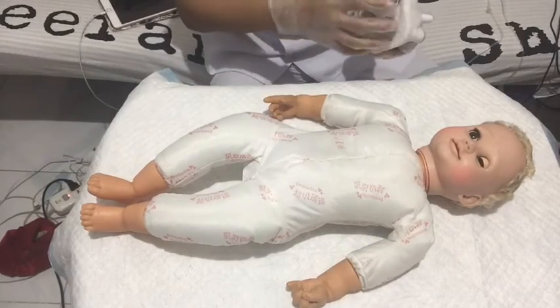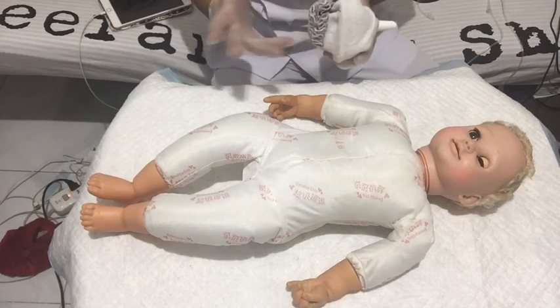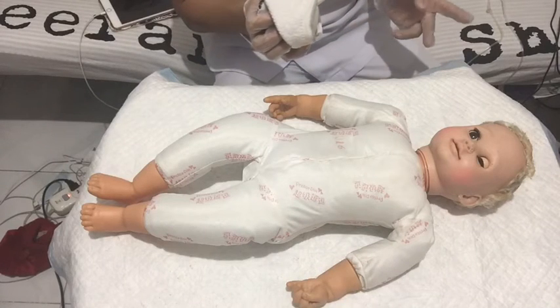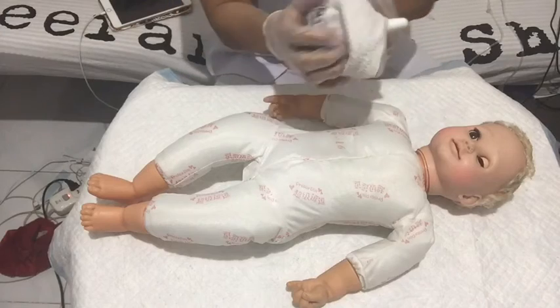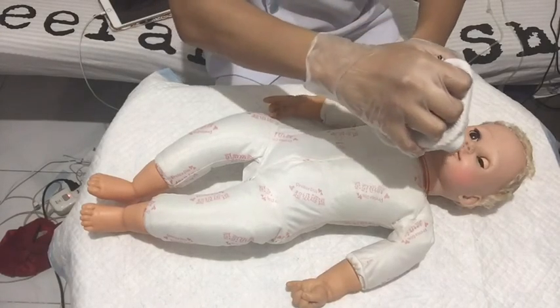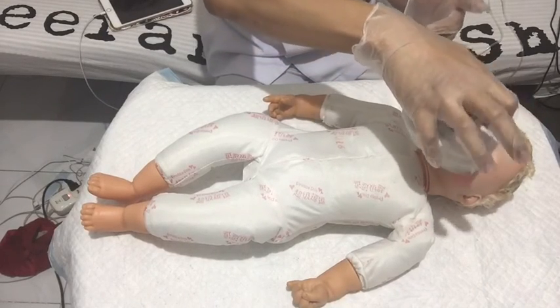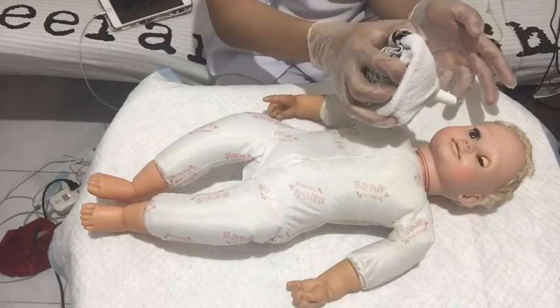Now for the bulb syringe, this is my makeshift bulb syringe. Something like this, you have to squeeze it and it will push the air out. What we do with the bulb syringe is exactly the same process as with the suction machine. But before putting it in the baby, we should squeeze it. After squeezing it, we can put it either in the nose or in the mouth. After that, we release the bulb, and the air will go back into the bulb to draw the mucus out of the nose or the mouth.